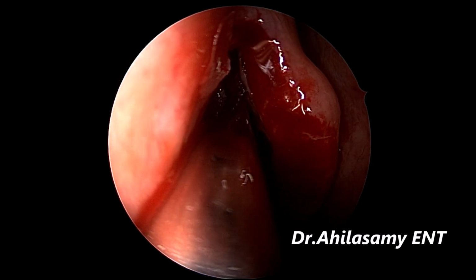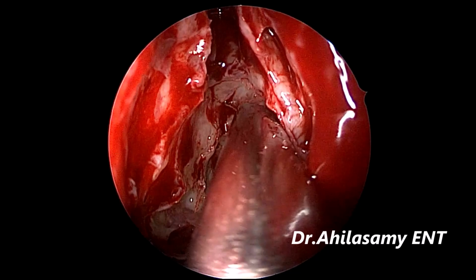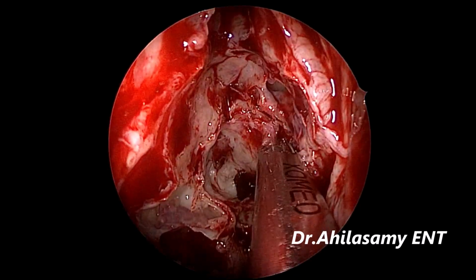So be always very gentle to the mucosa. Don't leave behind bare bones. You will get post-operative crusting.